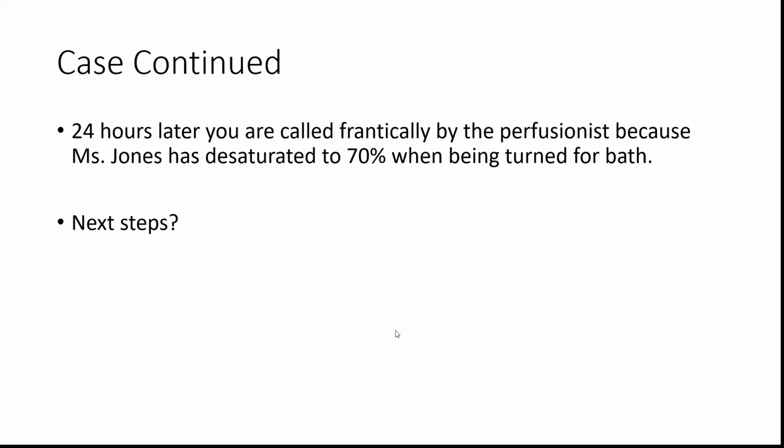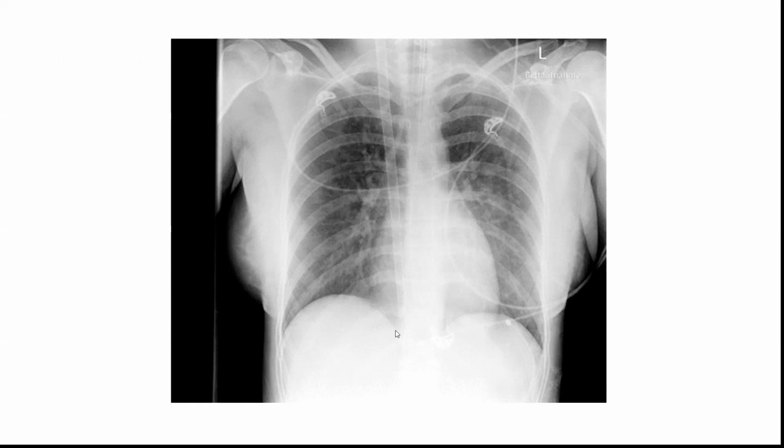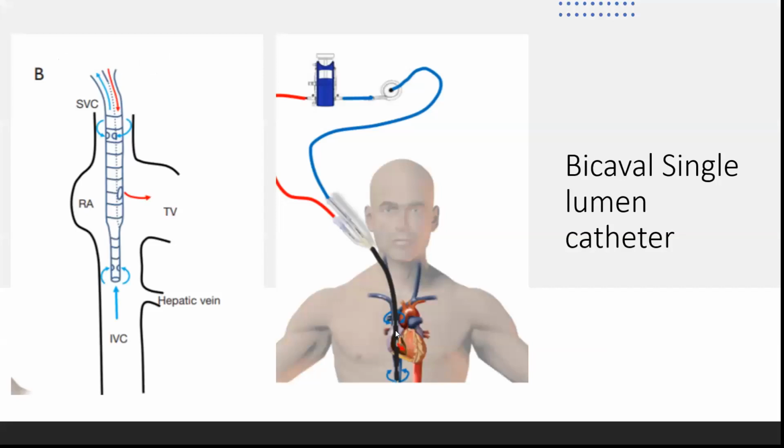Good. The SVO2 change. Maybe the venous pressure we talked about, did that change? And as Nor mentioned, flows. Good. So first, what'd you say, Nor? I mean, most likely it's a malposition, right? Because the patient was being turned. Yeah, yeah. So the X-ray.